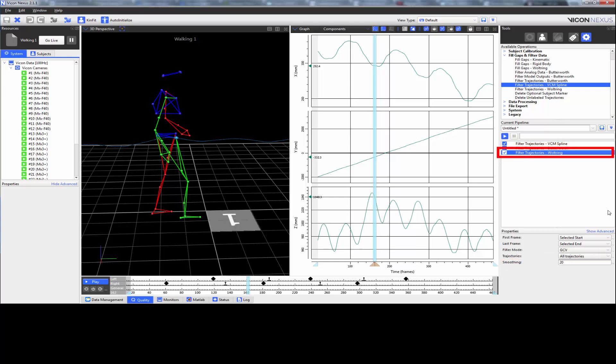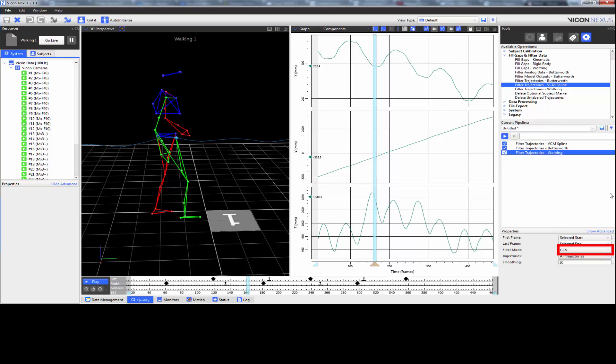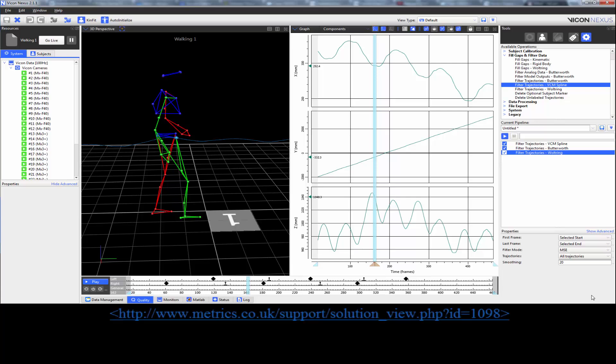The Woltring filter for trajectories allows you to choose between the GCV mode, which stands for General Cross Validation, or the MSE mode, which stands for Mean Squared Error. The GCV mode automatically detects the level of noise within the trajectories and chooses its own filter. The MSE mode allows you to manually select the level of noise, with the units being in millimetres squared. By default, this is set to 20. More information can be found from the website that is below.